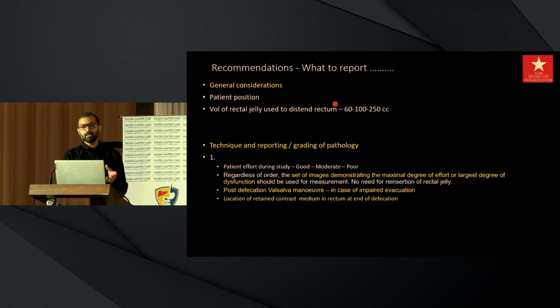Following this, the other important feature that as a radiologist I need to mention is the effort of the patient during the study, and this can be well visualized with movement of the anterior abdominal wall during straining and during defecation. If I'm not able to see movement of that anterior abdominal wall during straining and defecation, and not able to see movement of the pelvic floor, it basically means that the patient is not making a good effort to evacuate the rectum.